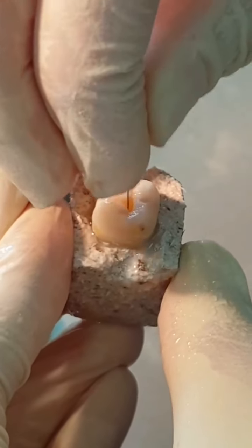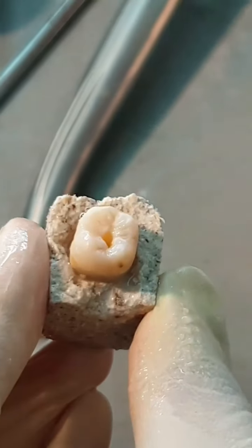Now we should extend the access cavity to mesial to find the mesiobuccal and mesiolingual canals.